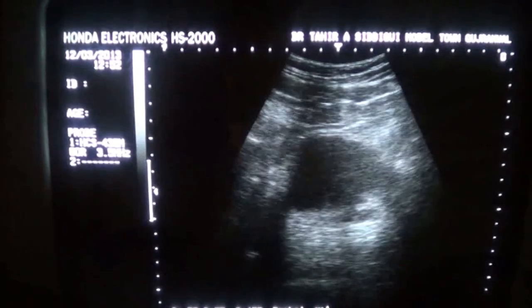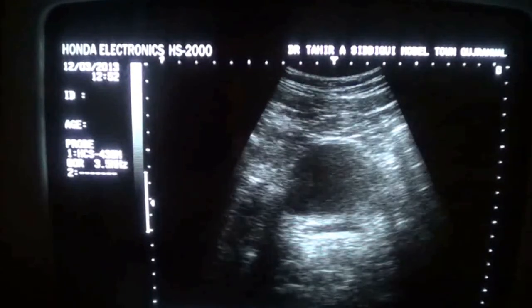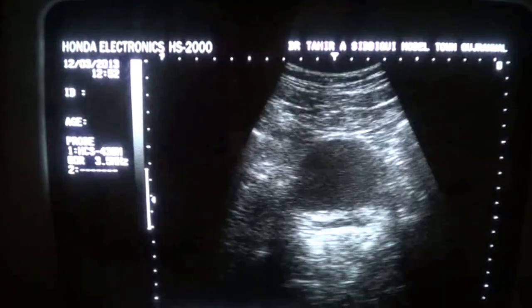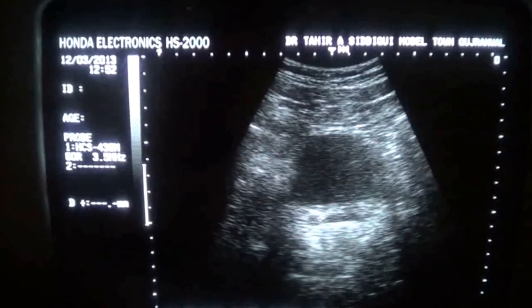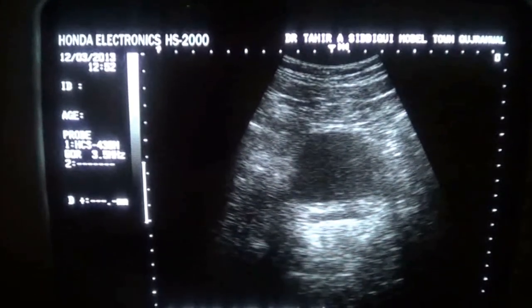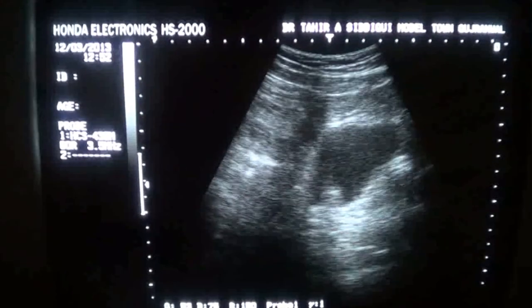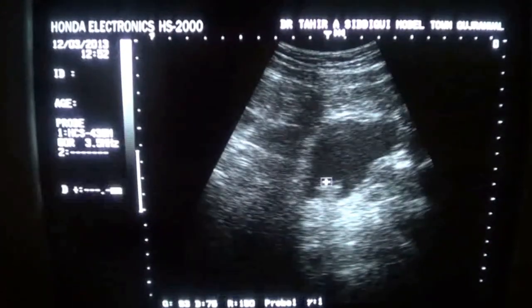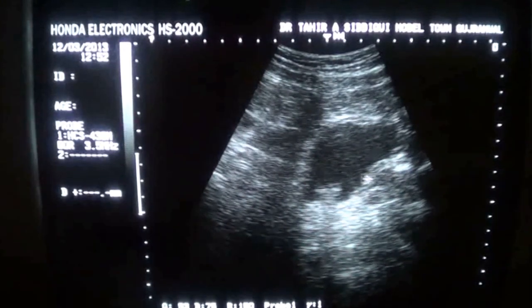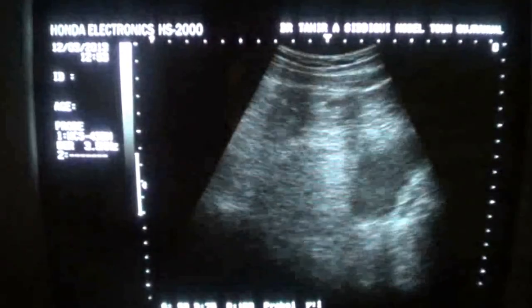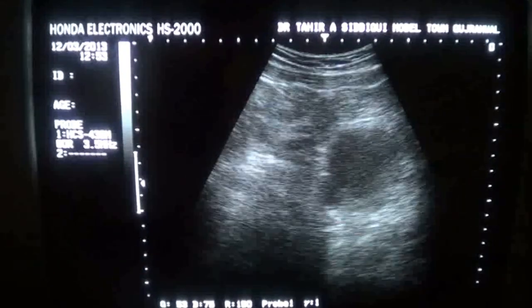This is the urinary bladder of this 50-year-old patient. This is the urinary bladder, this is the seminal vesicles, and here you will see the prostate in longitudinal section. This area is the prostate in longitudinal section. No pathology is seen relating to this region.